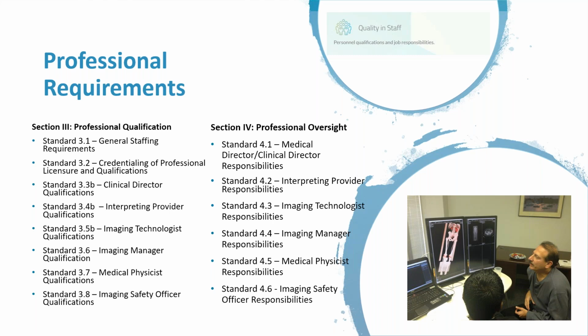And the reason why we've done this is because we want to acknowledge that there are different requirements for people that are using ConeBeam in different ways, and that it's just important that people are prepared to use it properly for the use case that they're going to use it for. But obviously we can't hold people using it for dental to the same thing we would hold a podiatrist to. We have to make some accommodations for that.